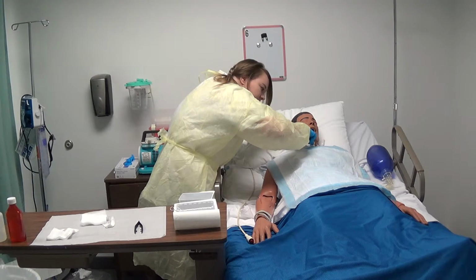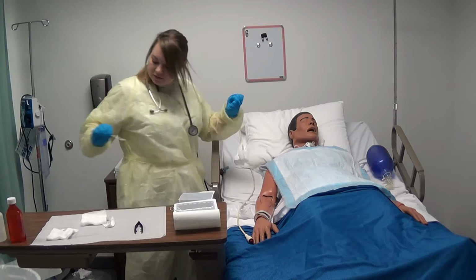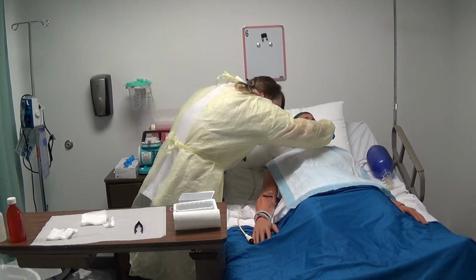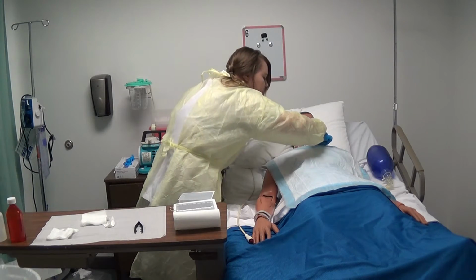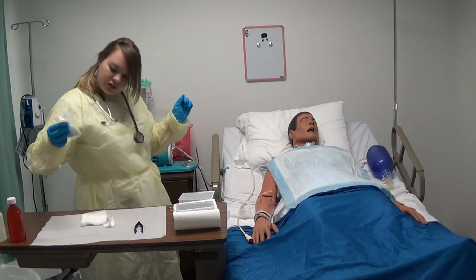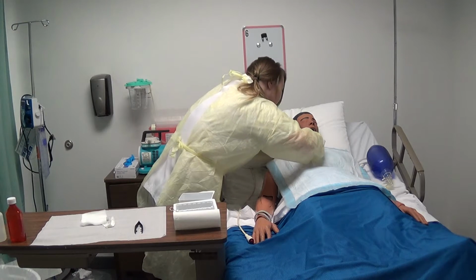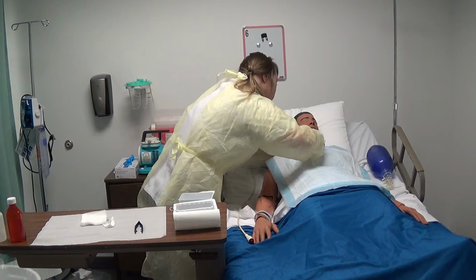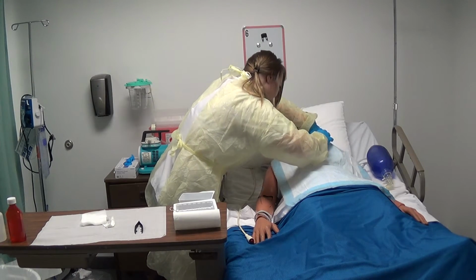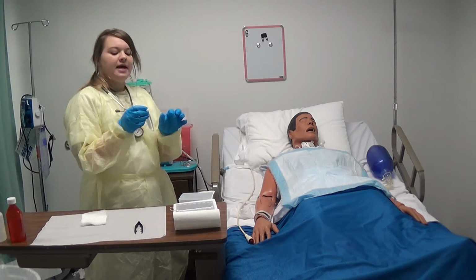I'm going to clean from the midline to the outside. And I'm using normal saline on my Q-tips. I'm going to replace a new dressing. And I would also need to put on some new ties.